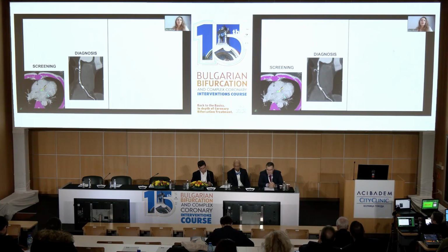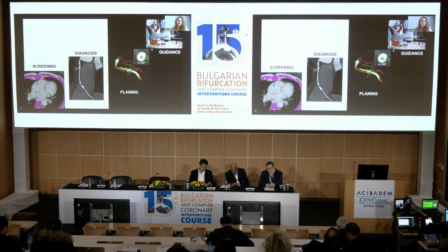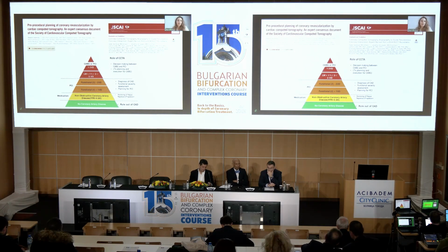However, just in the last maybe 5 years, we started seeing CT as a valuable tool to actually plan our procedures, and not only our procedures, but our most complex procedures. Not only to plan the procedures before the cath lab, but also to use it to guide our PCI inside the cath lab. And in the last, again I say 5 years, both the European and American invasive societies started recommending CT.